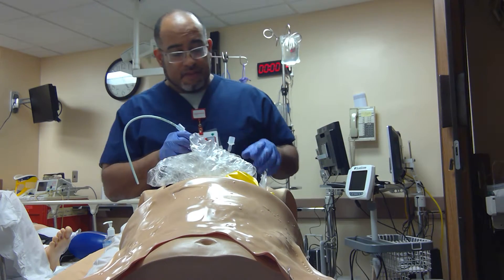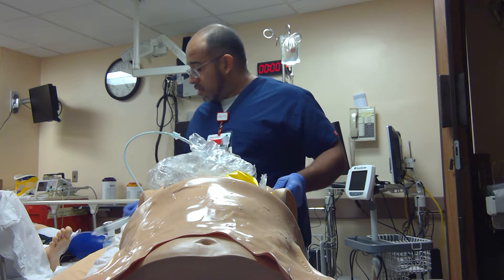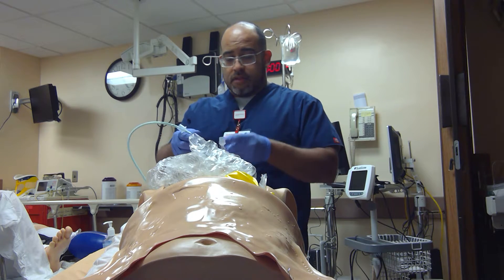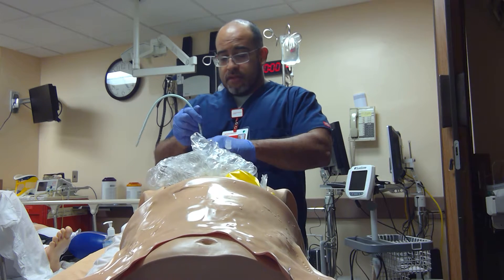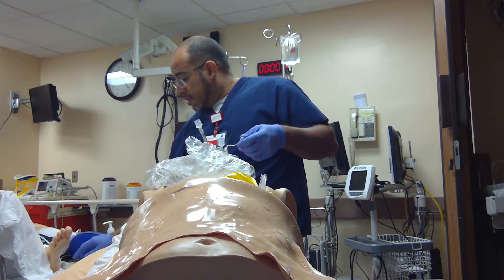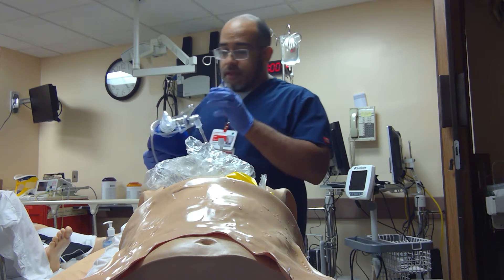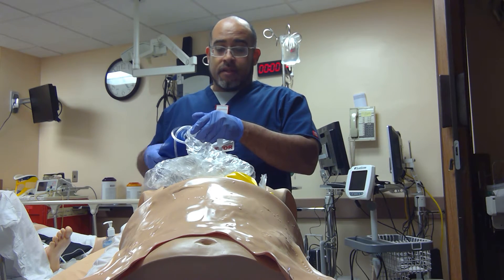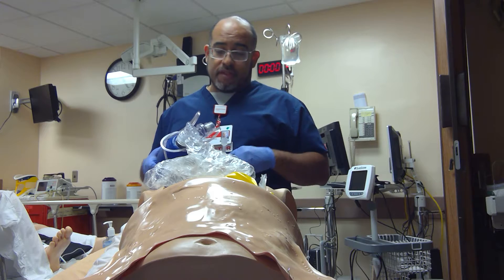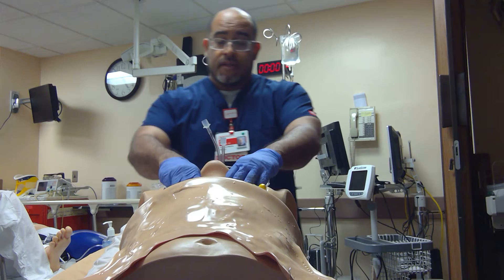I isolated the left. Go back to inflating that. Try to sneak deeper — it's not trying to go deeper. It's probably being impeded by the plastic at the right. There's some rise, but hopefully this is the best outcome. Not the best I think I could have done, but this is how it worked out.